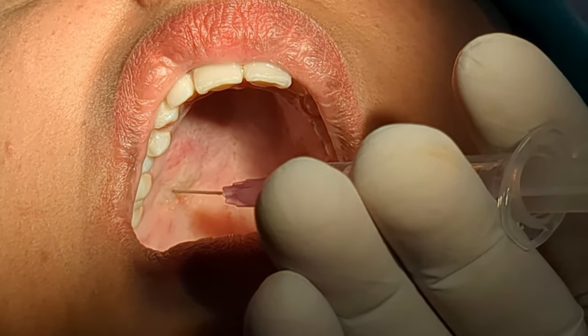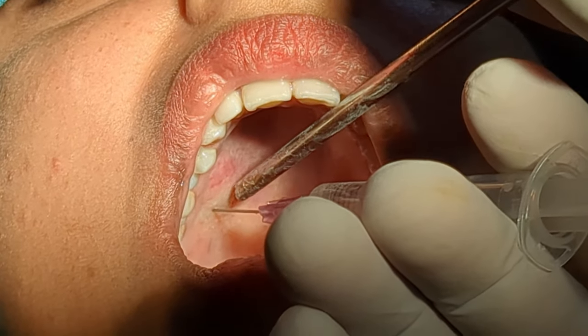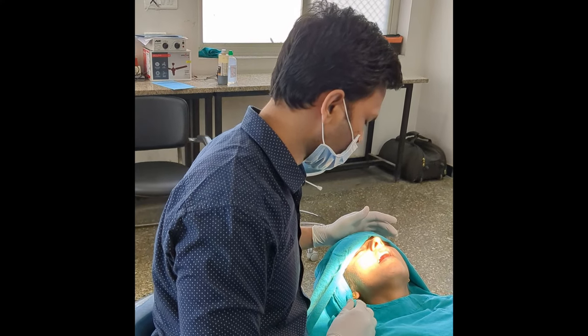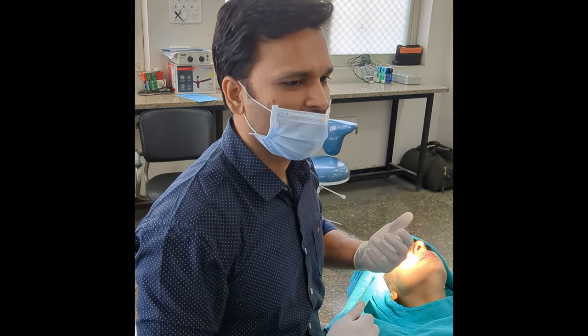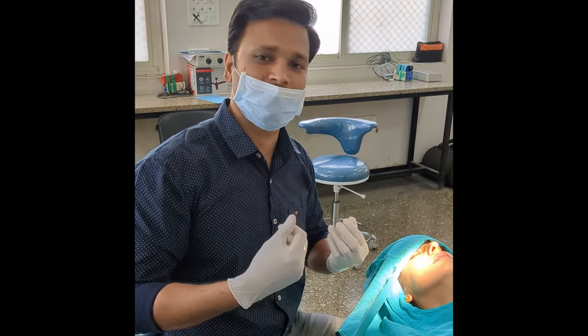An important thing to note, which is not given in the textbook: when I withdraw the needle, there will be a drop of LA that comes out. Make sure you suction it so that the patient doesn't have to taste the LA. The taste of local anesthesia is very bitter and the patient might have gag reflexes. To avoid any gag reflex, we suction the LA solution to make sure the patient doesn't taste it.